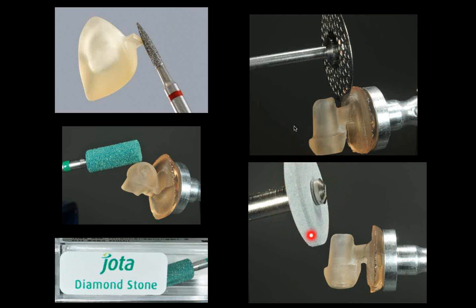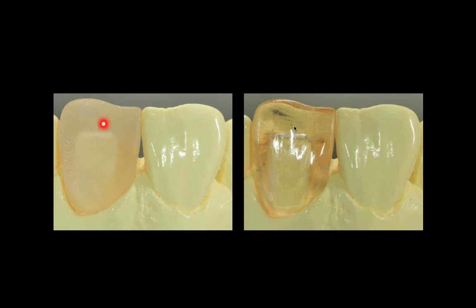These are just standard polishing wheels to pre-polish ceramic. And with these polishing wheels, you can basically polish all the scratches away. Because what you see here, this matte Suprinity, is full of scratches. So after polishing, it gets clear. So before it looks like this, and after polishing, basically it looks like this.